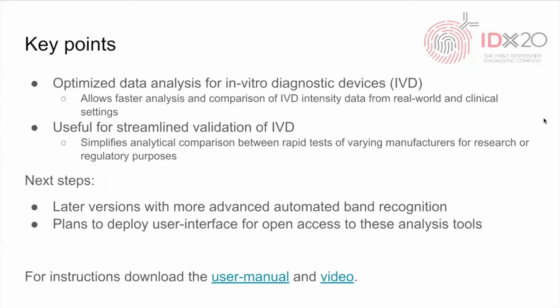So with this faster analysis and a comparison of the intensity data from different settings, we find it might be useful for streamlined validation of these devices, since the analytical comparisons can be made with much more ease.